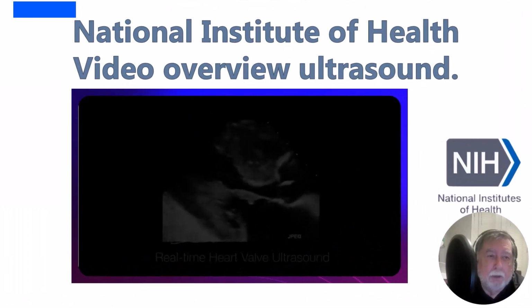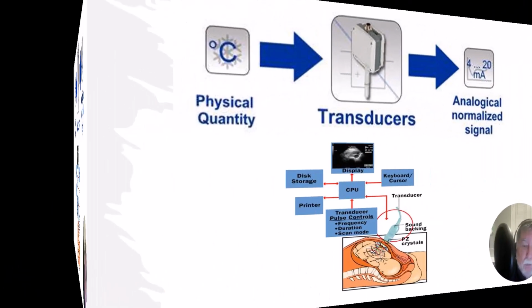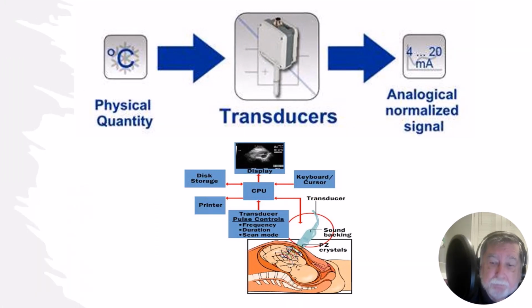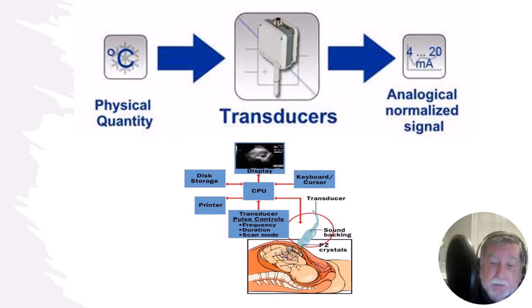This is an overview of ultrasound, and we'll go in more detail as we go along. Remember that in dealing with the topic, some theoretical considerations have been simplified. The aim here is not an in-depth technical expertise or an in-depth knowledge of physics concepts utilized in ultrasound. What we begin with is understanding that most imaging is necessarily an aid to diagnosis. Our main aim is to better understand the digital concepts of ultrasound imaging. Technical aspects, which have been greatly simplified here, only serve to facilitate the understanding of the imaging process.